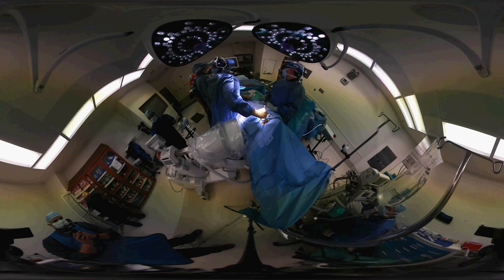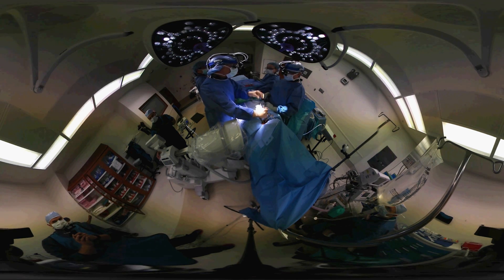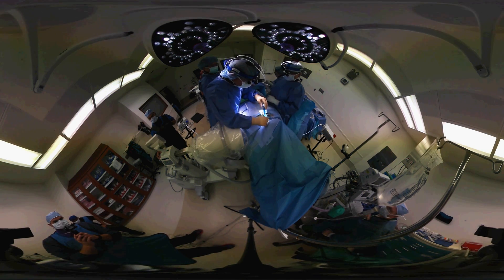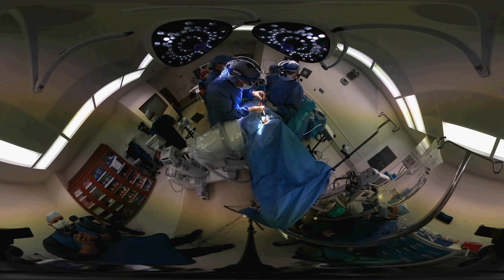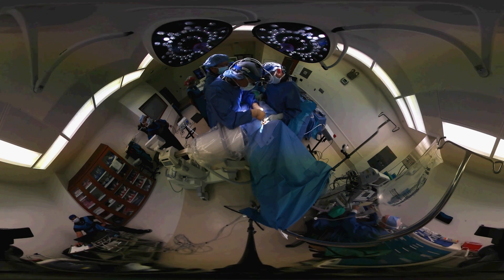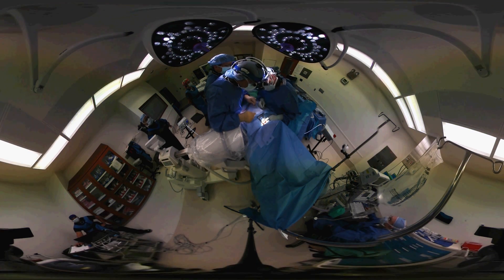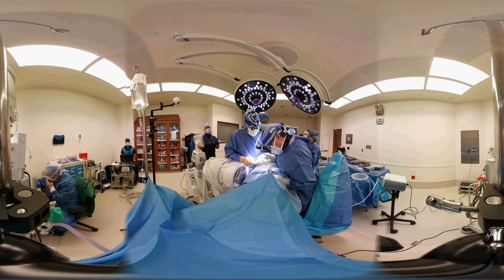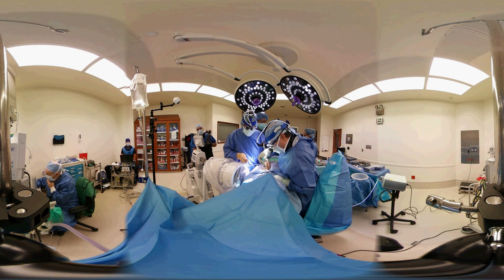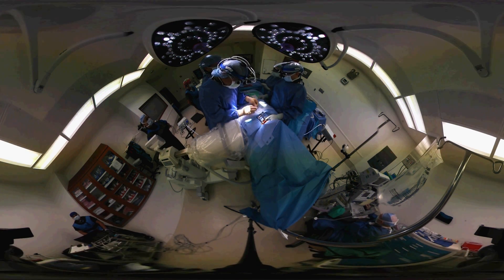I'm putting the artificial disc in. I'm tapping it to the proper positioning and now I am disengaging the holder. I'm checking the position of the artificial disc to make certain that, number one, it is where it should be by visual cues, and then we will check x-rays to make sure it's where I meant it to be placed. I'm inspecting the edges and making a determination that I like the positioning. We're looking to make certain there's no bleeding from any of the bony edges, and now we are putting some material called Surgifoam in the neck that helps stop the capillary oozing and prevents blood accumulation in the front of the neck.